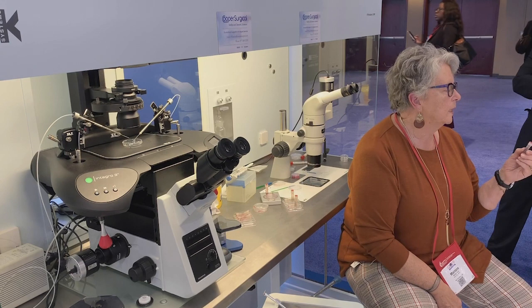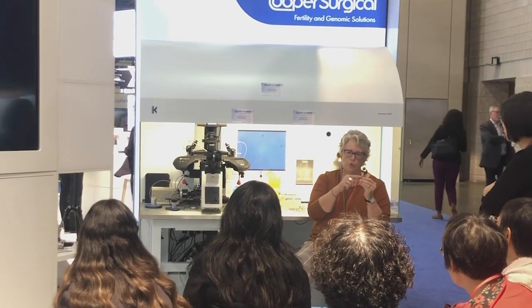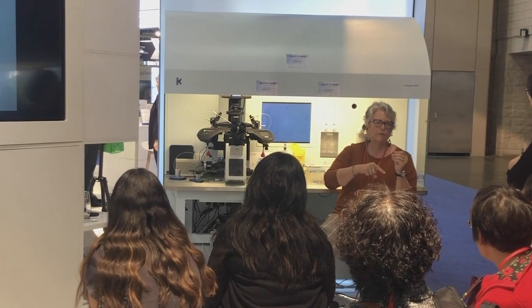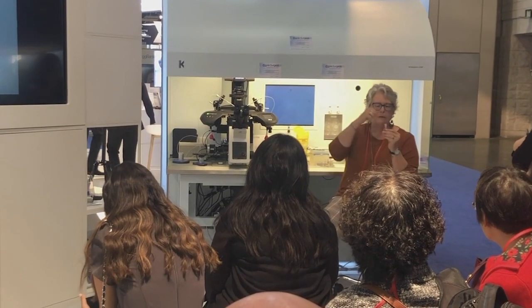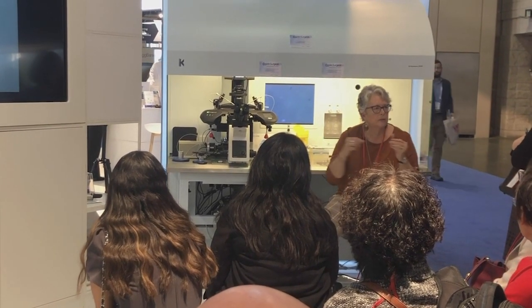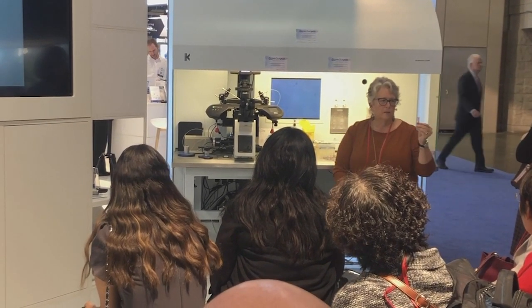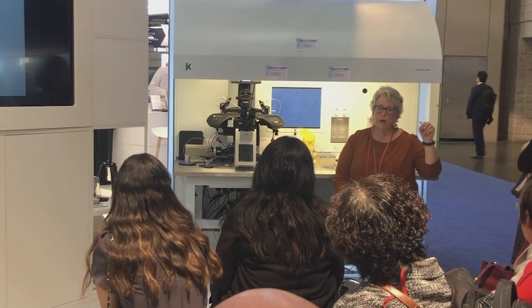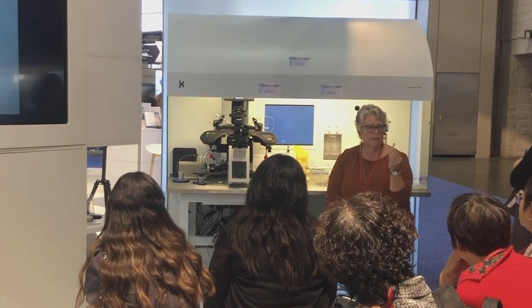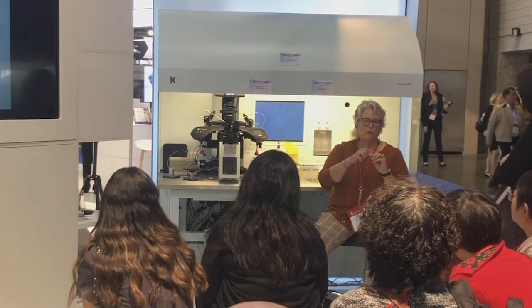Initially, we set up one incubator just for vitrification, and we measure the temperature in a vial to make sure. We want that temperature between 37.0 and 38.0, the temperature in the fluid in the vial. I don't care what the temperature of the incubator is. I only care what my embryos are seeing. So we'll put the dishes and the vials into the incubator overnight. If I had a CO2 incubator, I would probably not do that, because I can't guarantee that these are gas impermeable through the lid.